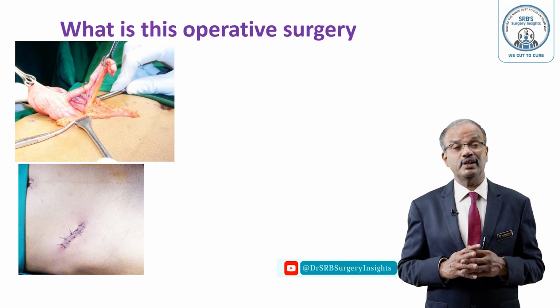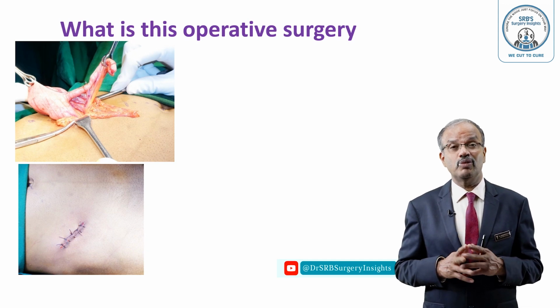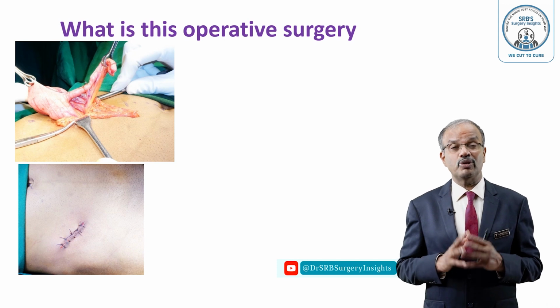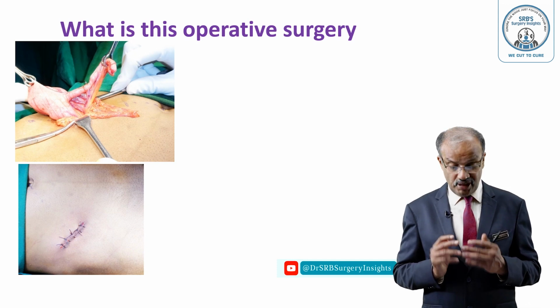Ligation of the base of the appendix properly is most important to prevent fecal fistula, leak, and further local infection. And control of the appendicular artery by ligation is also very, very crucial, to prevent reactionary hemorrhage.